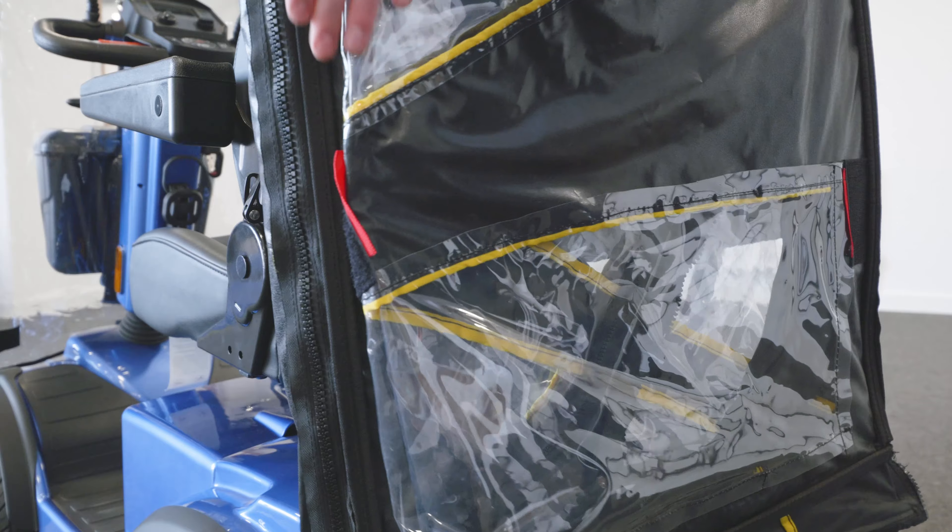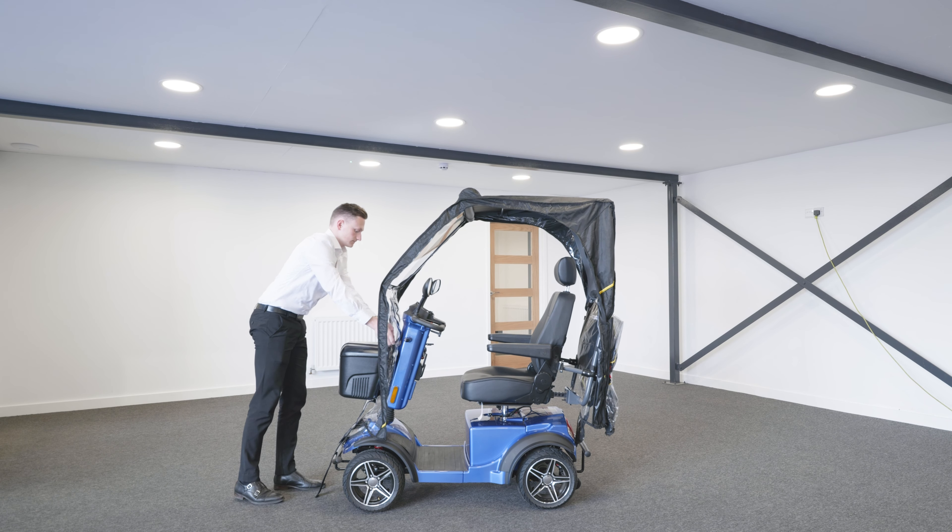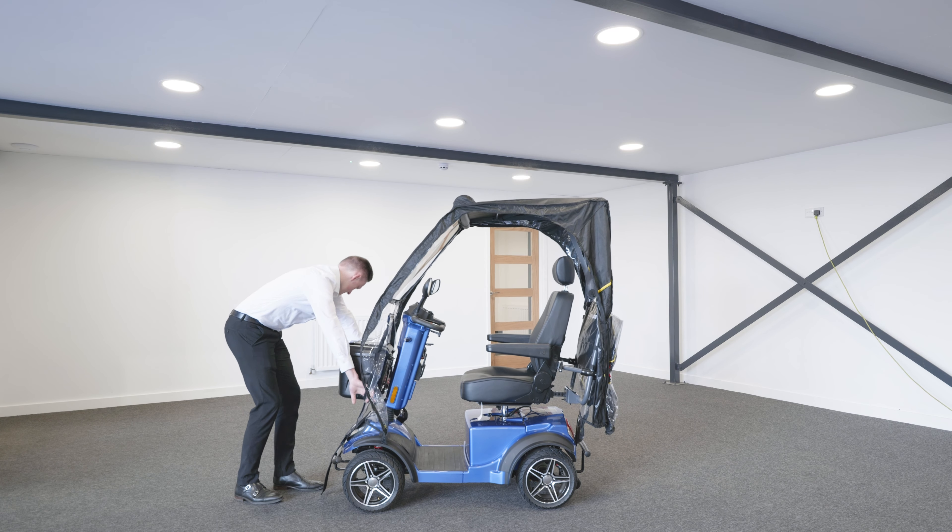Detach the Velcro from the front bumper. If your scooter has a front box, you'll need to open the front panels, lift around the front box and close them up.